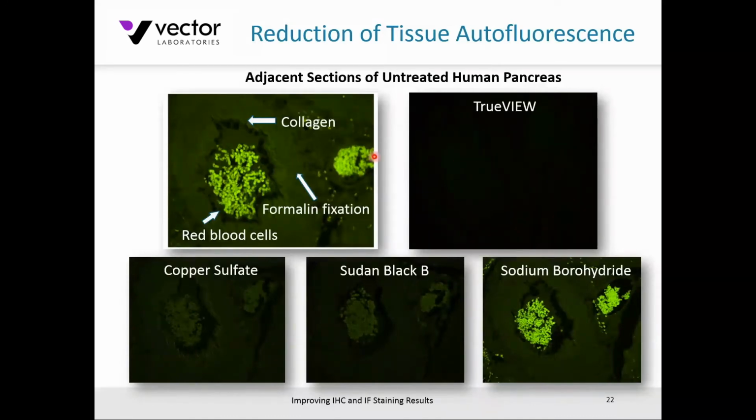And again, this is an adjacent section, believe it or not. You can see essentially zero staining on this adjacent section when treated with TrueView. It drops out all of the autofluorescence from red blood cells, your collagens, and aldehyde fixation.